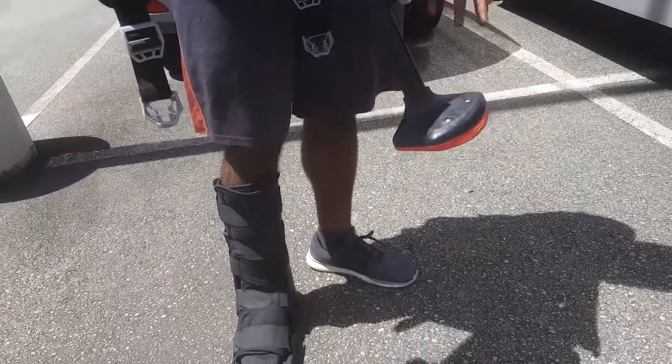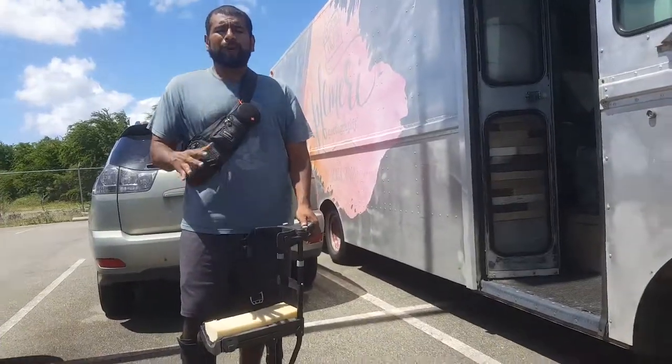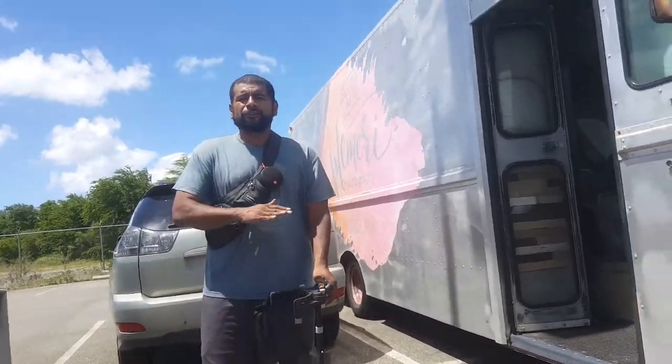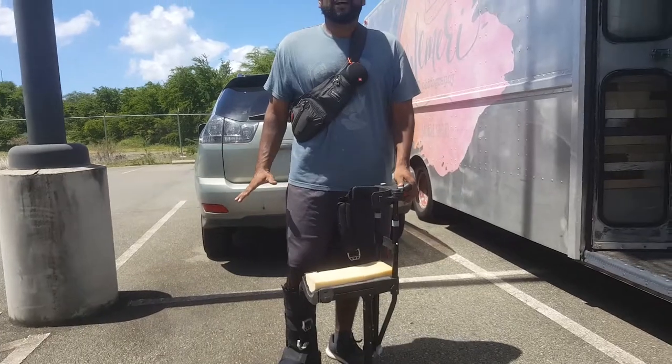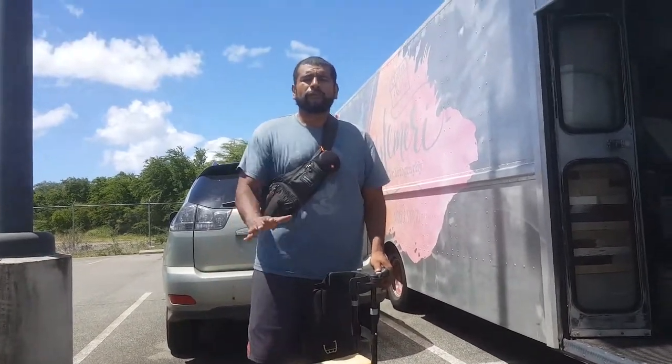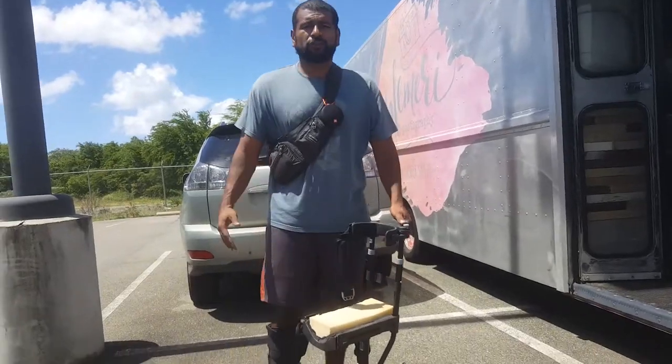I recommend that you start out with a little bit shorter of a length. Once you get your balance on it, then I recommend you go even or a little longer, so that you're more comfortable and can actually walk a little bit faster. Otherwise you kind of hunch in if it's still too short.